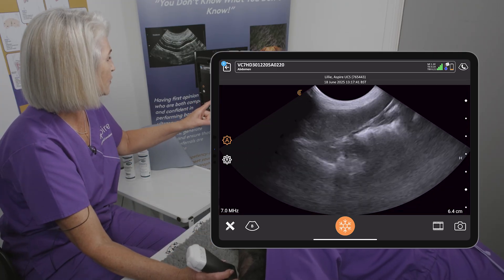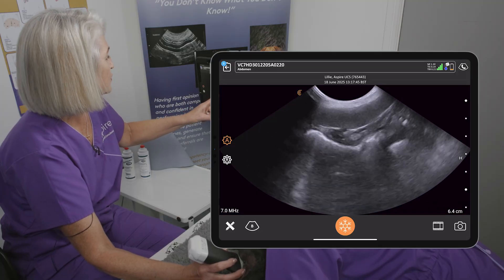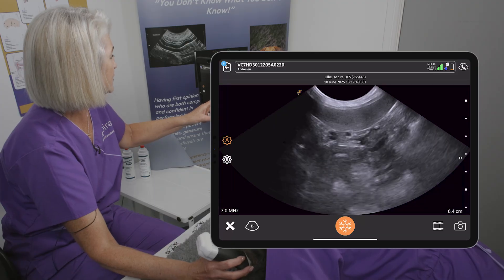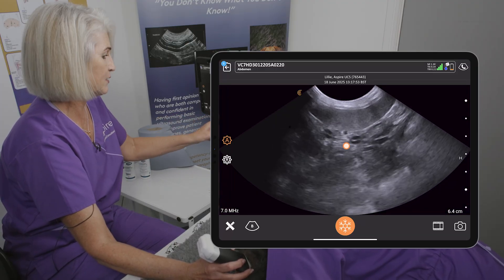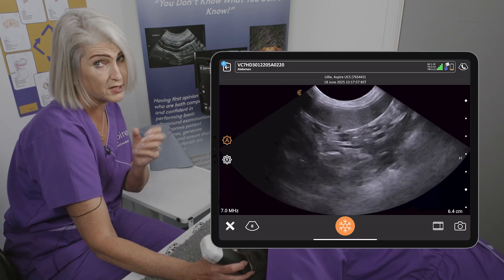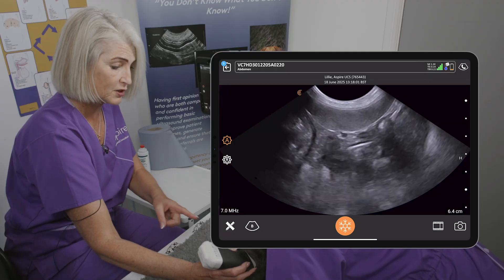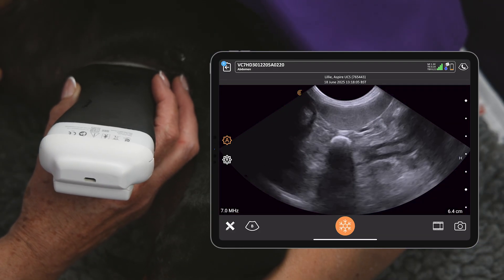Here is our spleen — we're looking all the way through it. Scanning back along towards the dorsal aspect, there's a vessel — one of the highlight areas of the spleen. It's important to see those vessels going in, because if they're coming out the wrong way there could be a potential partial torsion or torsion of the spleen.